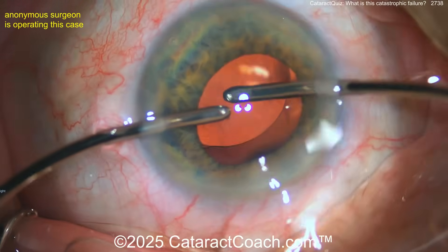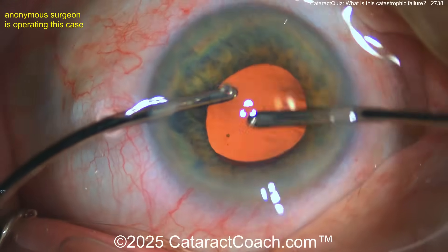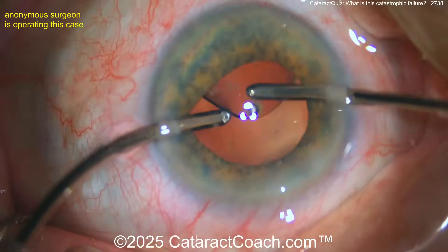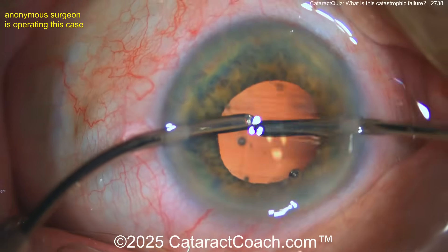All looks pretty reasonable at this point — get that lens positioned, standard approach. Now taking out the phaco handpiece, some bubbles okay. Going behind the optic — good technique. Everything looks pretty reasonable at this point.